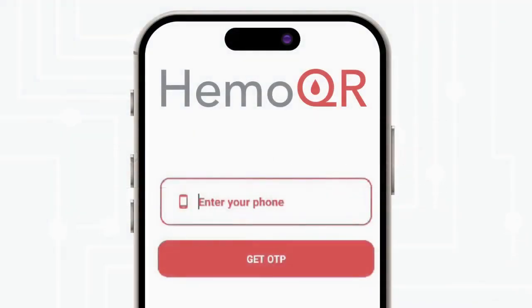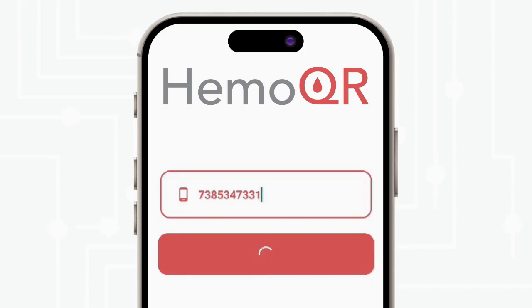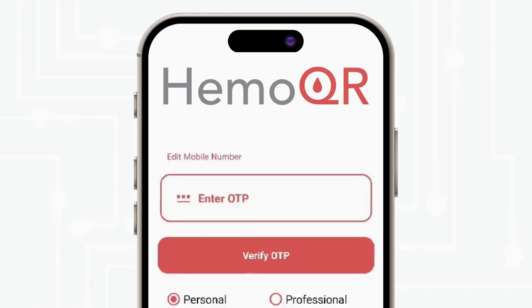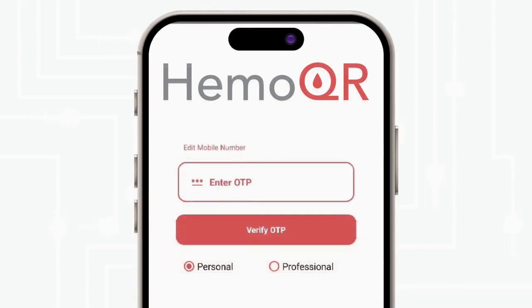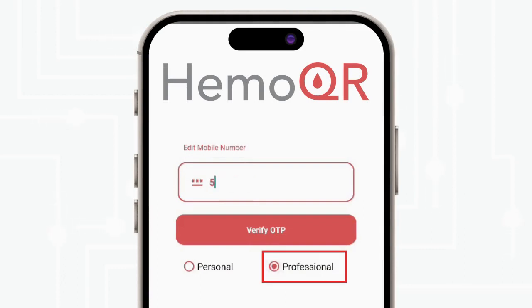Login with your mobile number. Enter the mobile number and click on Get OTP. You will receive the OTP in a message. Click on Professional to conduct screening, then verify your OTP.